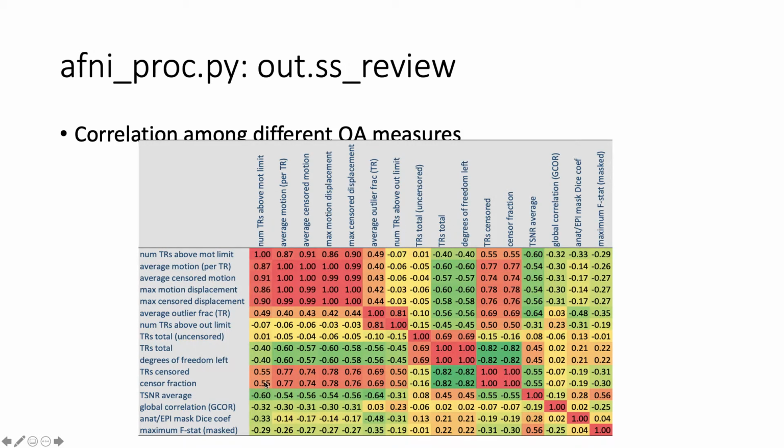And you can imagine your signal to noise ratio is going to be anti-correlated with the number of TRs that you removed. The stronger your signal, the less you remove. Basically, then you have decent or clean data, and you didn't have to remove a whole lot. It's a good way to review your data and know your data as you try to do your contrast of interest and write that up and hopefully get published and get grants and things like that.